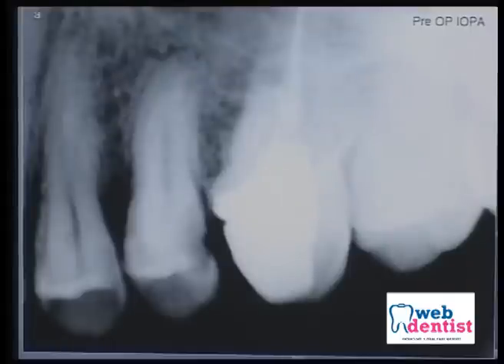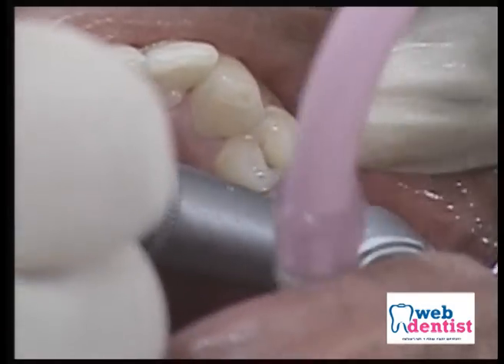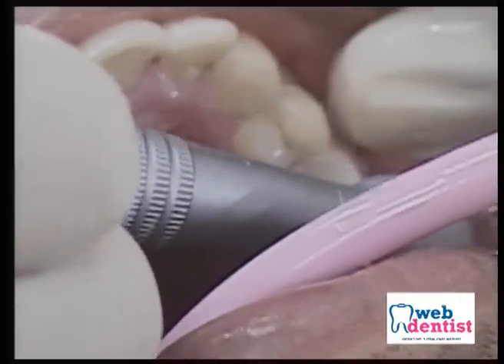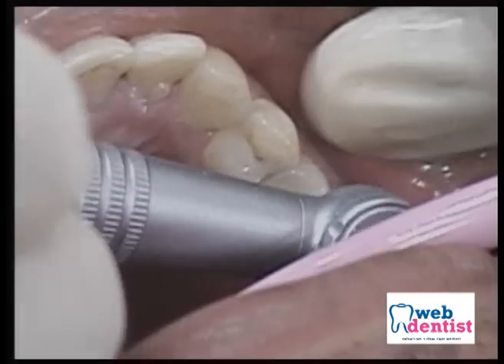What we see over here is not that good, because of which they can't do good instrumentation. Access is access to success. Access cavity preparation will give you a straight line path to the apex. So it's very important to do a good access cavity preparation.